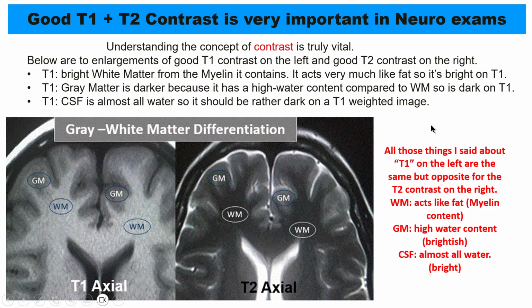Okay, any questions on that, guys? Okay, because I want you guys to have an eyeball to look at these, because you may get an image like this and they might say to you, what weighting is this image? And you need to look at it and go, okay, what's bright, what's dark, okay?